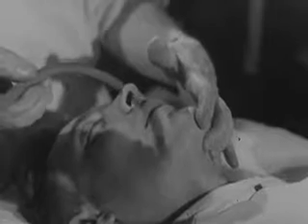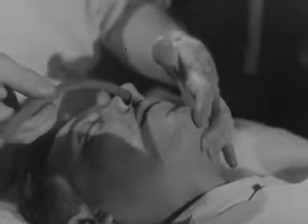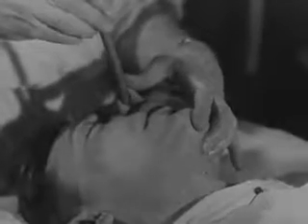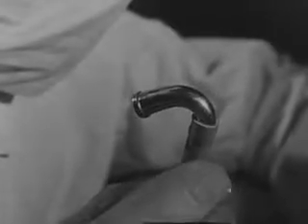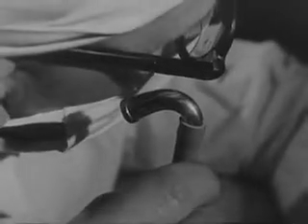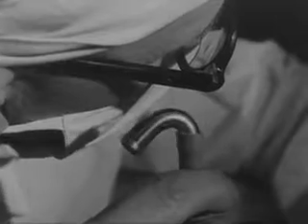Successful blind intubation depends entirely on the sense of hearing, so the anaesthetist must listen carefully to every sound that comes through the tube. If the ear is kept close to the end, the current of air can be felt as well as heard. As long as the breath sounds increase in intensity, the tube is following the proper course towards the glottis and may be steadily advanced.